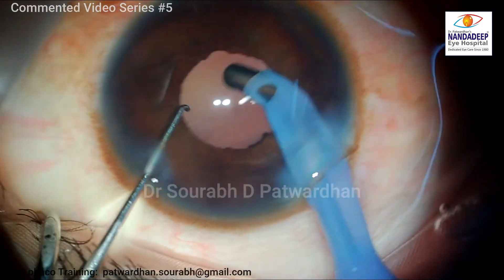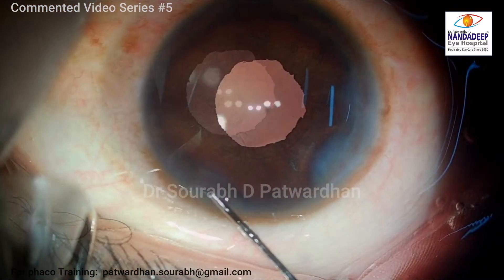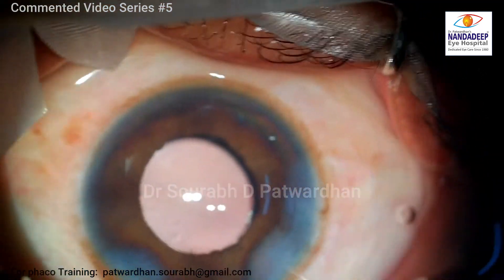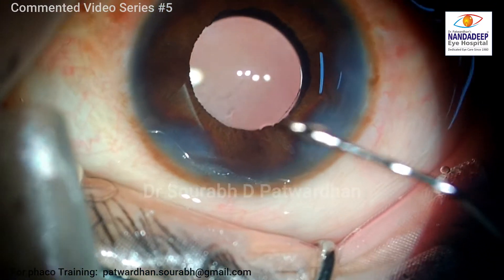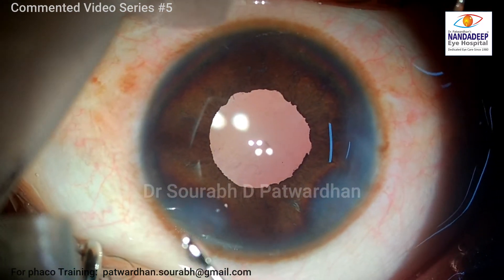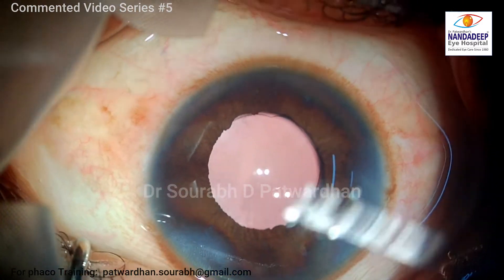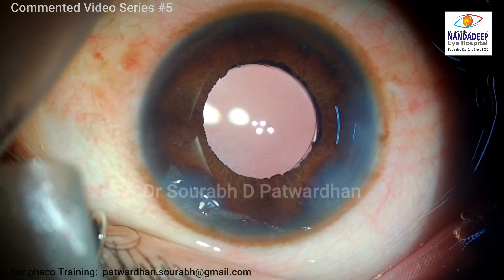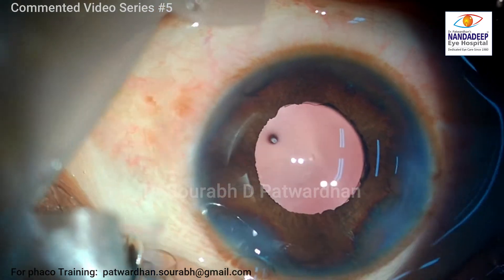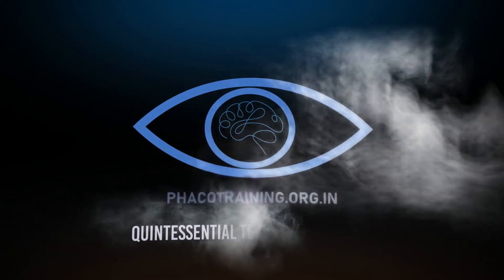Whenever we have a young patient with unilateral traumatic cataract, we have to think of many things. We have to examine the patient very thoroughly preoperatively to look for lens issues like subluxations or posterior capsular dehiscence. Also look for the pupil size in the undilated state — it is very important. Speak with the patient about the choice of IOL, because at a young age they naturally want the best IOL technology, but we have to decide based on what suits the patient best. The refractive EDOF IOL is definitely an exciting way to correct these eyes, and if the patient is willing, we can go ahead with EDOF or even trifocal — it is not a contraindication.